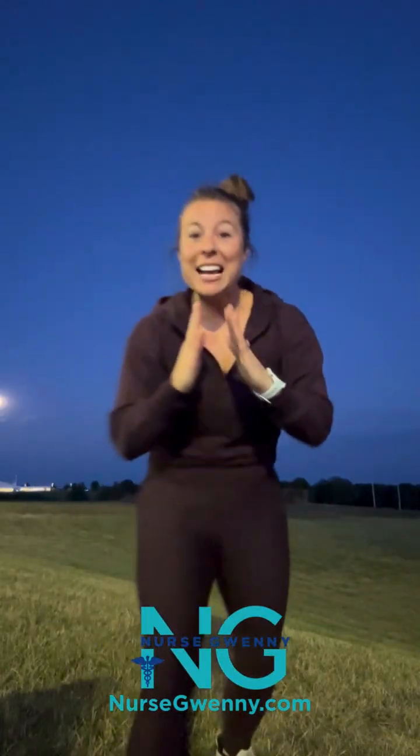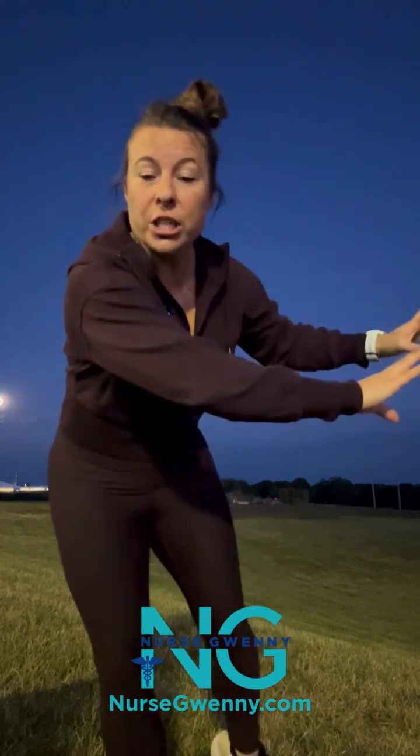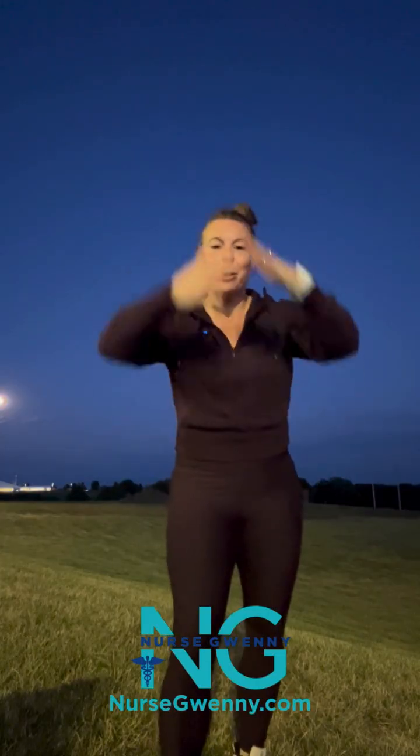But let me set this up and talk to you guys about invasive hemodynamics. And we measure these invasive hemodynamics using a tool called the pulmonary artery catheter. The other name we call it is the Swan-Ganz. So this is a catheter that gets floated into the right side of the heart. The right side is deoxygenated blood, right? And the purpose of the right side of the heart is to push blood to the pulmonary vasculature where it can pick up oxygen molecules, work its way back around to the left side of the heart where it pushes it out into systemic circulation in order to perfuse and oxygenate the rest of our body.